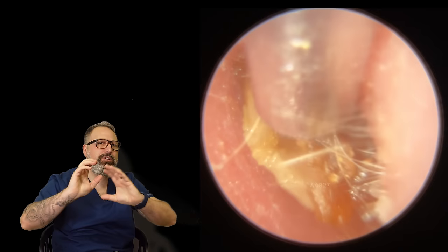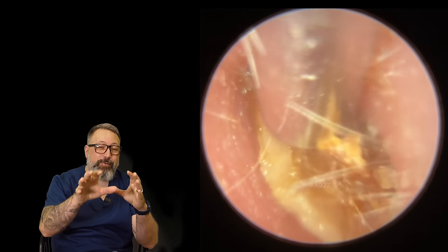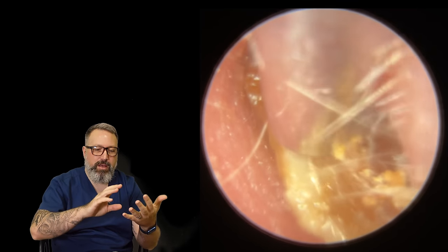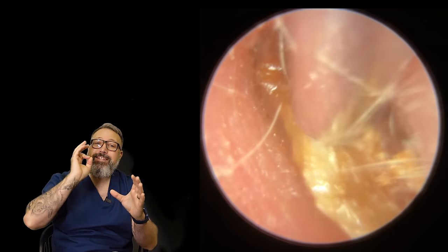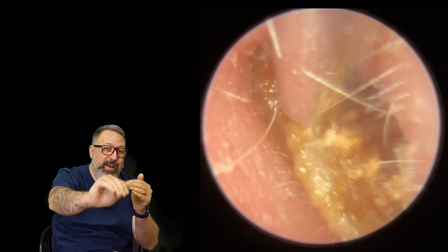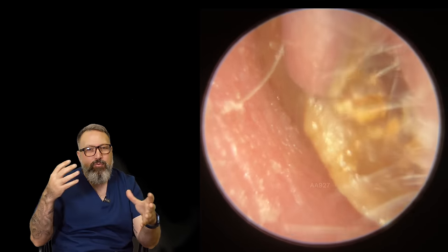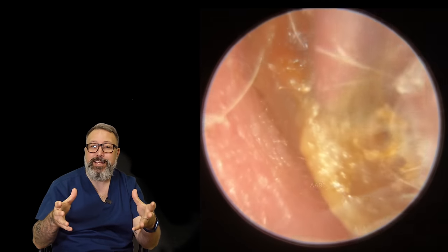And I know you're all going to say, well, you could use a tool and get behind it. It's really difficult when it's like this, only because when you're filling that entrance to the canal, trying to get the tool to work. Any curettage tools - we're talking Jobson Horne, Rosen Surda, Bartok - those kind of things. It's very difficult to get over the top of this plug, because what you're going to inadvertently end up doing is pushing it further back in again. So if you can, you're better off trying to use suction and break it down, or at least try and wiggle it enough to pull it through the gap, which is exactly what Taylor's doing here.